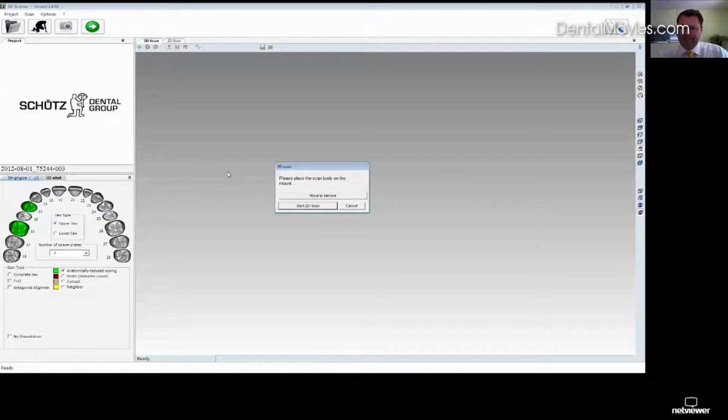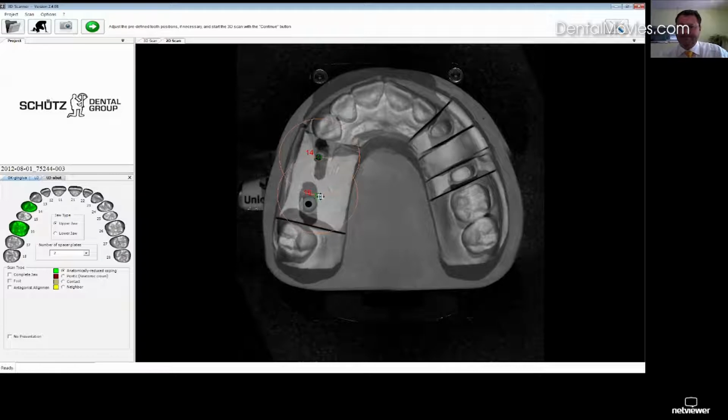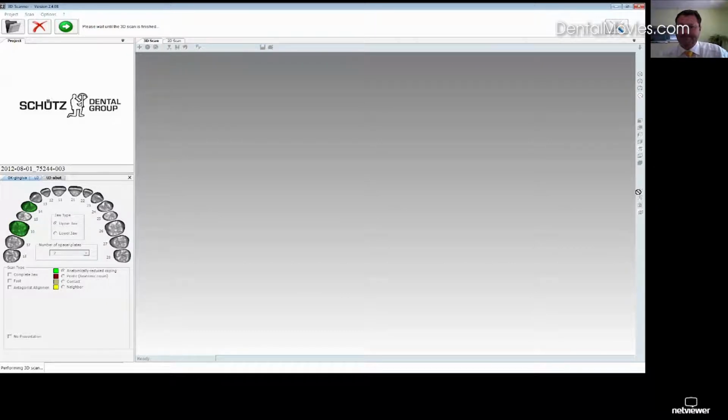The best position is with the flat side to the outside, but we will see it in the scanning software a bit better. Set the areas.